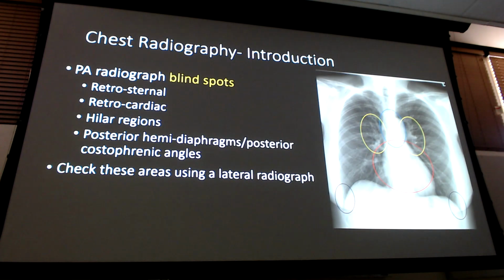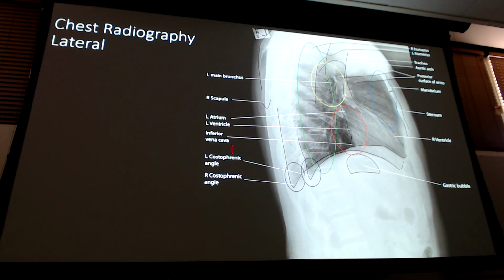So by the time we get to here, I just have soft tissue projecting. Because it went through those lungs and then went through all that soft tissue and took it all up. None of that had really hit the film. So that's why you can't see the posterior costophrenic angles on the PA or the AP, because these are the ones I can see. These ones I cannot by the time I penetrate. So we need the lateral chest X-ray to see those posterior costophrenic angles.